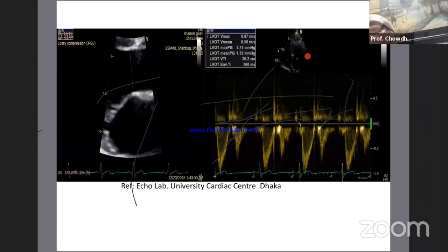And then we mark the envelope. We should try to avoid the flimsy portion. At times it is referred to as the chin and the beard, and we should not include the beard like this one. The complete envelope should be taken. Another way of knowing the peak is probably the point where this line and this line cross. That should be the peak point, and we should be able to delineate this point.